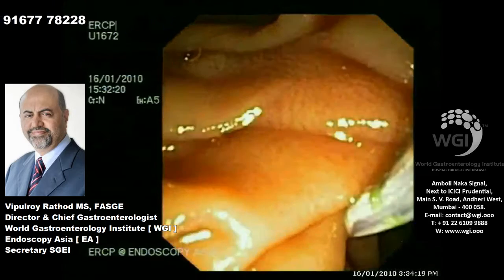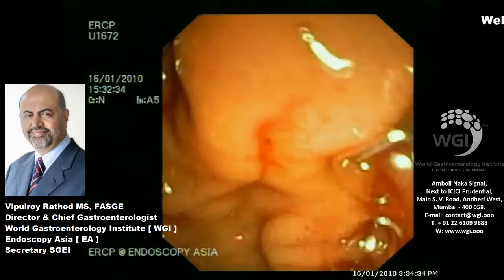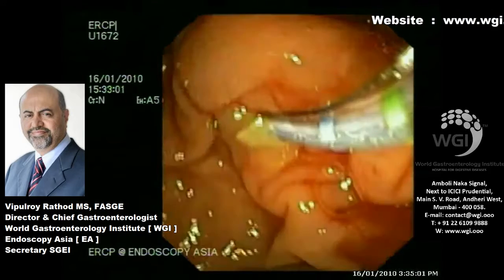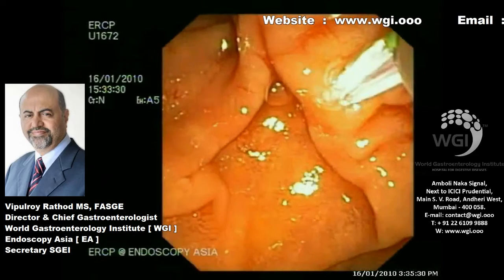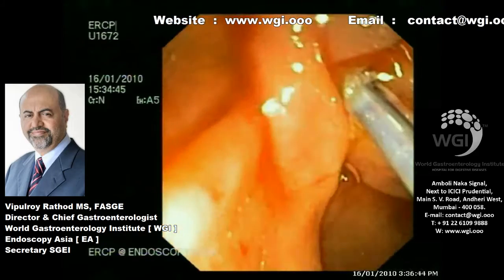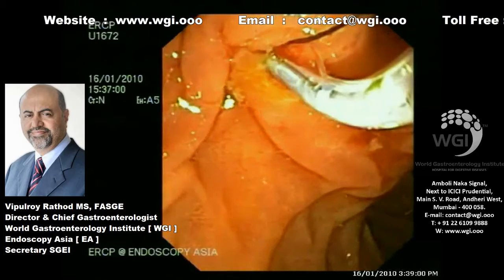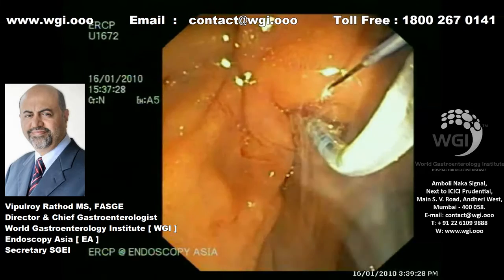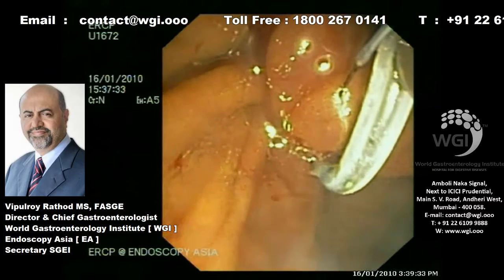Now, as I mentioned, whenever we have a pancreatic head or periampullary lesion, there is resultant periampullary edema due to obstruction of lymphatic channels. And you can see here significant periampullary lymphedema leading to impossible cannulation and deformity in that region. So we do try certain techniques, but they don't always work. So we change our technique here. We are doing a pre-cut with a sphincterotome now.